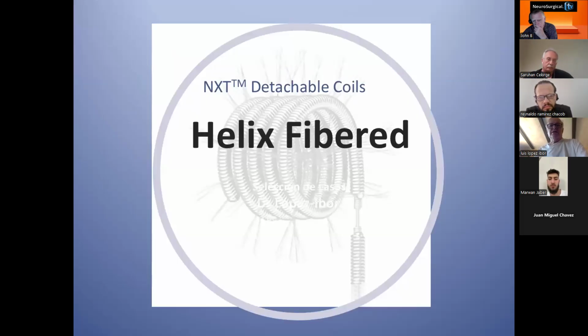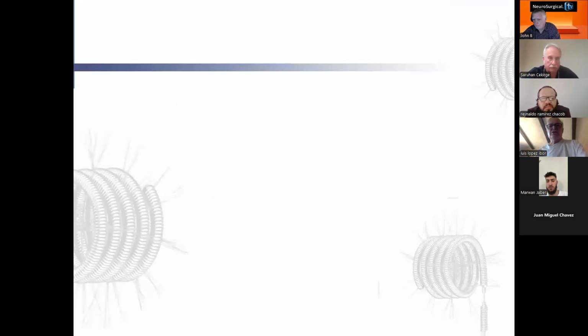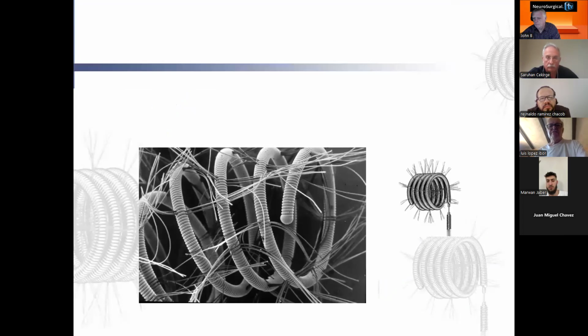I treated an aneurysm 20 years ago with fibered coils, Helix fibered coils. The company is Dendron. Boston also has this. The only difference with these fiber coils is the nylon. You have the coil and the nylon.